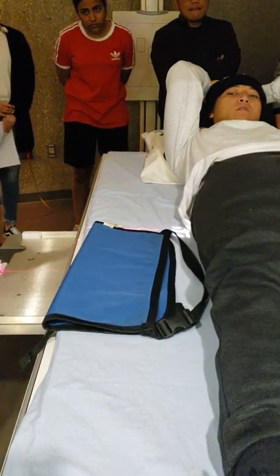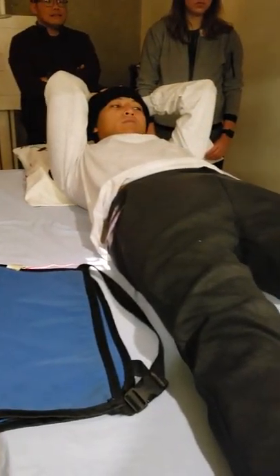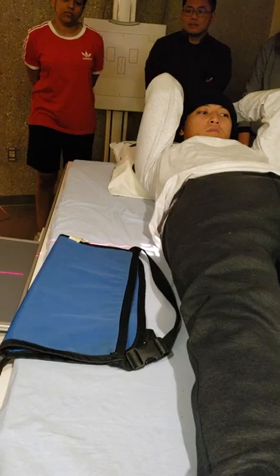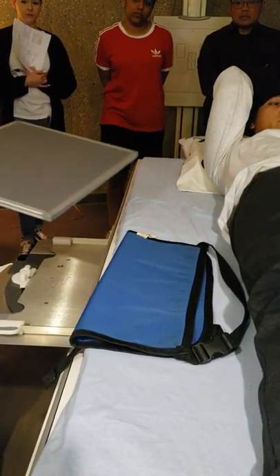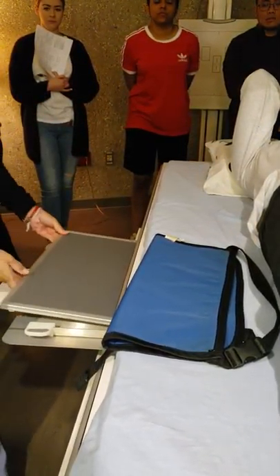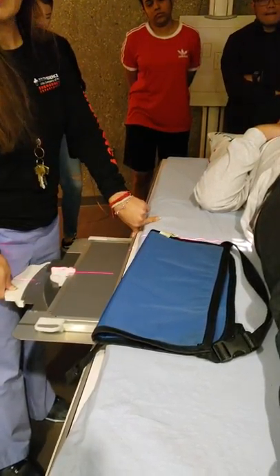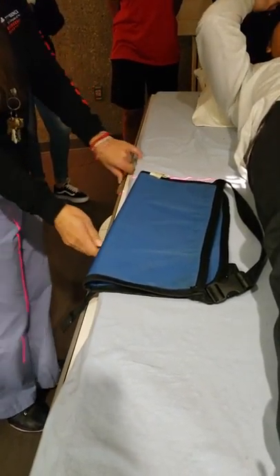We may need a 14 by 17 film. The first cassette I'm going to use is a 14 by 17. Notice where my blocker is — not at the bottom, because the leg is going to go down this way and up lengthwise. I'm going to begin with the femur first, then move to the hip, and then last the pelvis. Start with the femur so you can work the hip — you'll already be there.